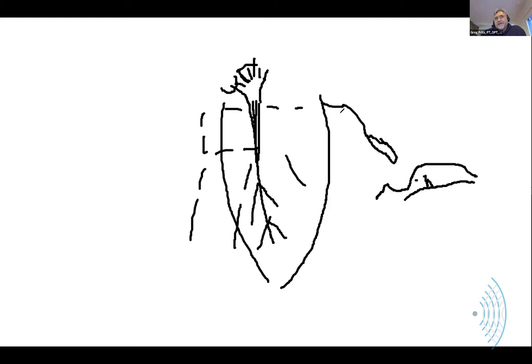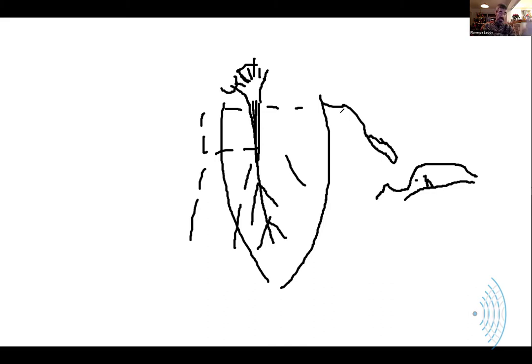It would be interesting to dissect a few of these out. Sometimes in dissection texts they describe the biceps coming up and having multiple attachment points, including into the roof of that section under the bursa. The real practical use of understanding this is when you're looking at supraspinatus and you see changes around the edge - the anatomy is very different near the leading edge - and if there's tendinosis the image quality falls down, and you see dark areas and think: is that a tear?